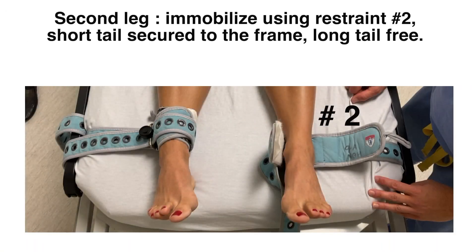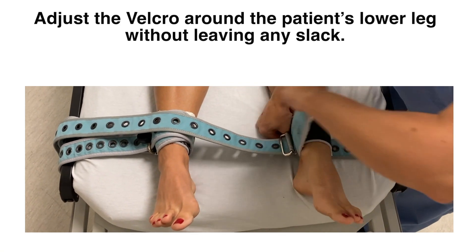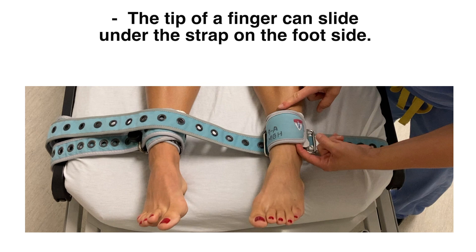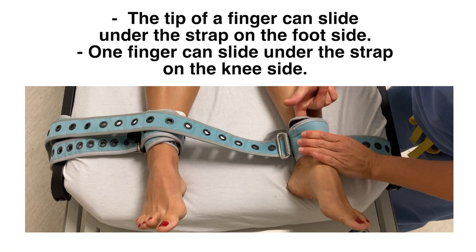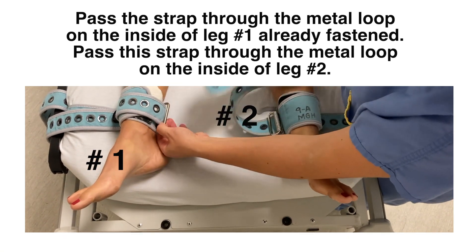For the second leg, use restraint number 2, which has the short tail secured to the bed frame and the long tail free. Adjust the Velcro around the patient's lower leg without leaving any slack. Check that the tip of a finger can slide under the strap on the ankle side and one finger should be able to slide under the strap on the knee side. Start by passing the long strap through the metal loop on the inside of leg number 1, which is already fastened.